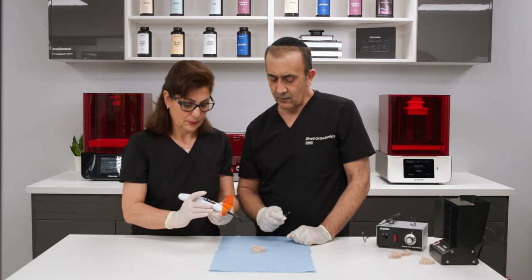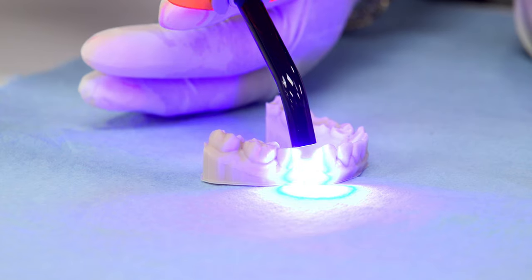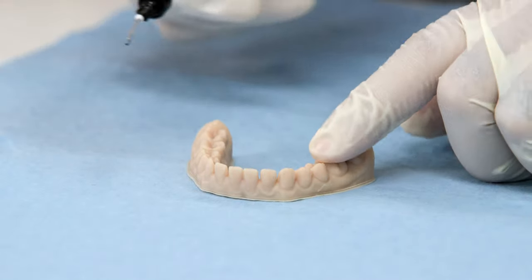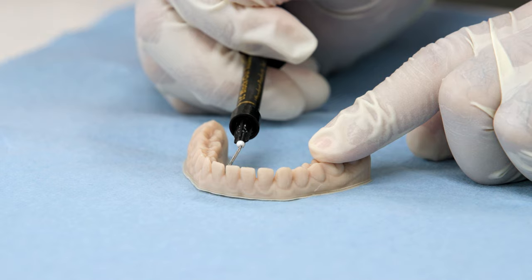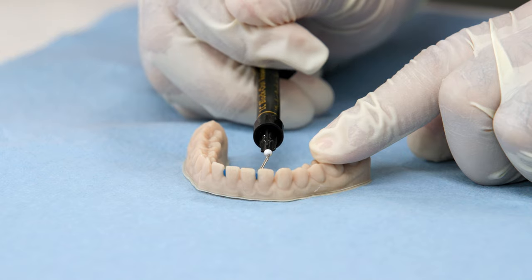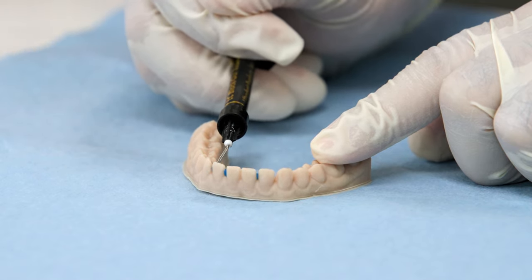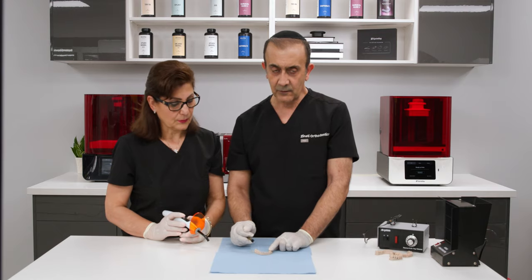We cure and move to our last case — the spacing case. We're going to fill in the interproximal spaces to make plastic removal much easier. In this case you have to be careful you don't overfill the space.